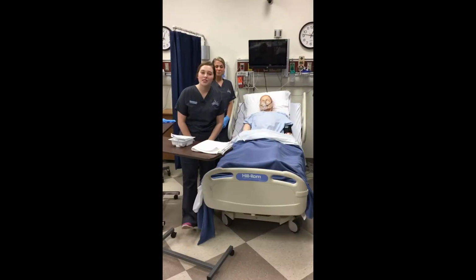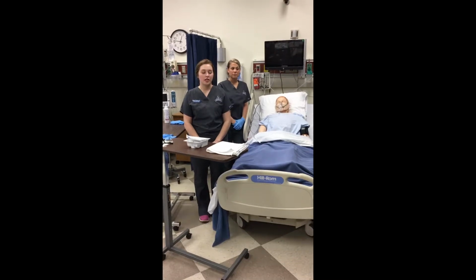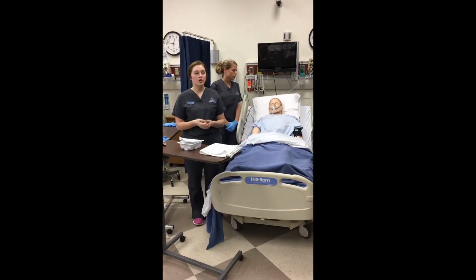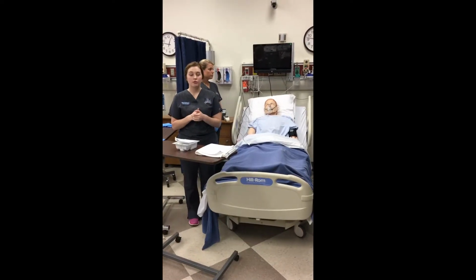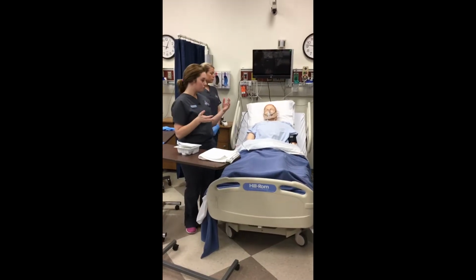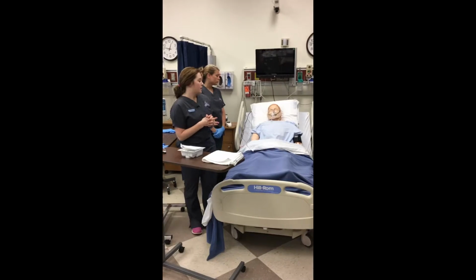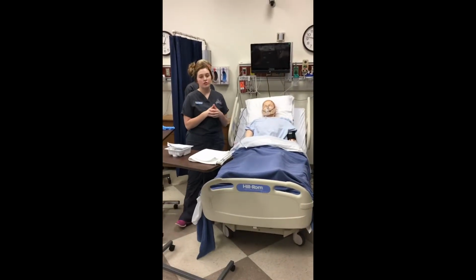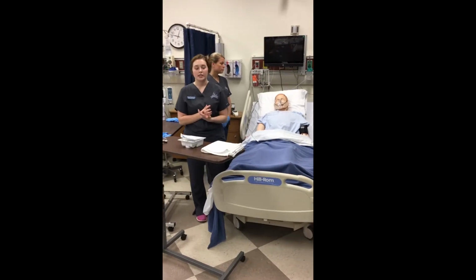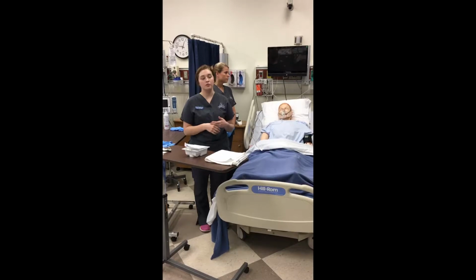Okay. For the second part of my video, I'm going to be demonstrating how to do nasopharyngeal suctioning. Again, you're going to want to assess your patient. You're going to look for the same signs and symptoms that you would with oral and oropharyngeal suctioning. Again, you're going to gather your supplies, which I've already done. You're going to then go into your patient's room, introduce yourself, identify your patient with 2 patient identifiers, and explain to them the procedure and what's going to be going on and how they can assist you.